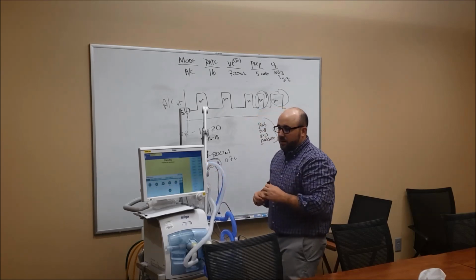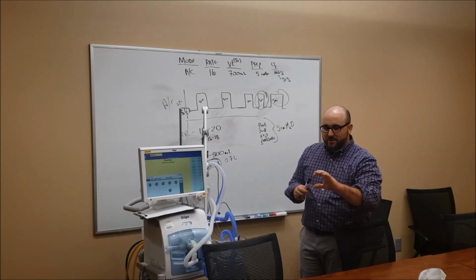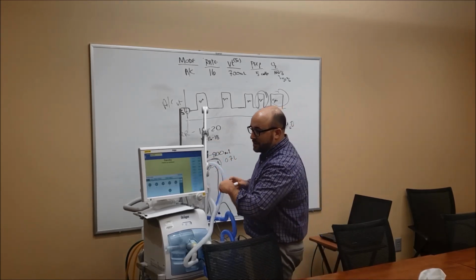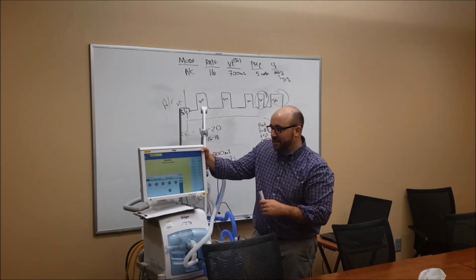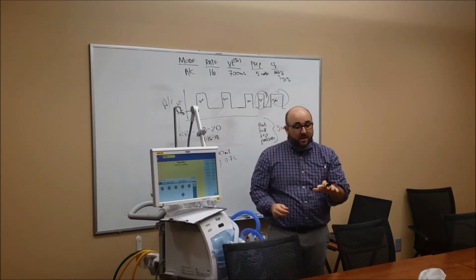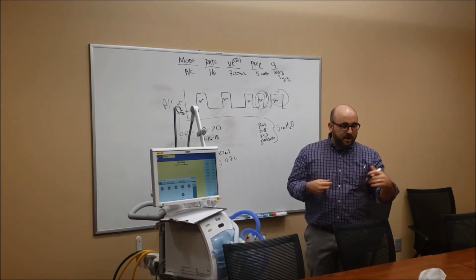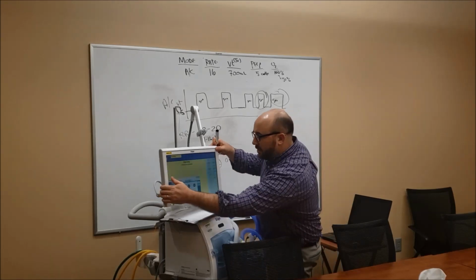Okay, so this will be the best way to look at it. If you have your patient, you're going to have some numbers across the bottom and numbers across the side. The numbers across the bottom are going to be your settings. So in this case, you see some settings on here. Can you all see it? Okay, cool. I'm going to put some things in here, and I want you to think, if I was a nurse up in the ICU, how you would read this. So in this case, let me do some changes here.